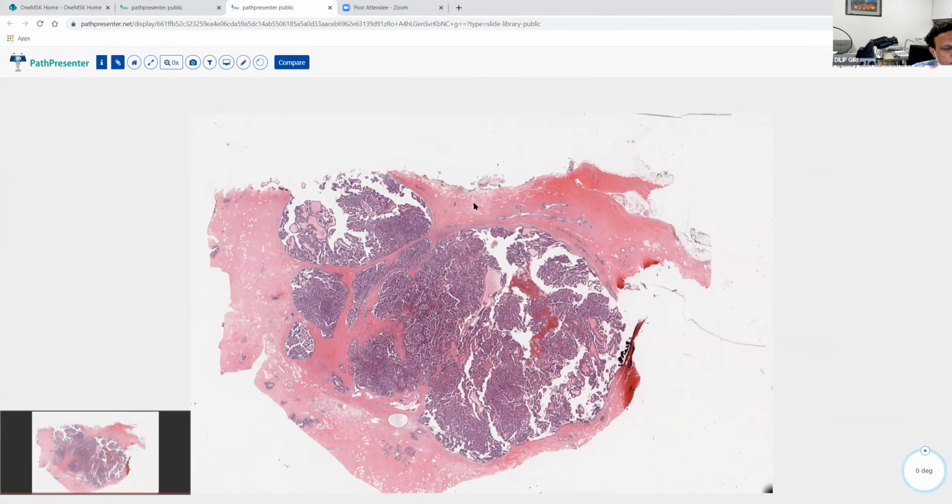Because now you clearly see what you recognize as invasive ductal carcinoma. In other situations, the invasion may be like the basement membrane here being broken, and then the earliest infiltrating clusters coming out. And then there may be reactive changes in the stroma.